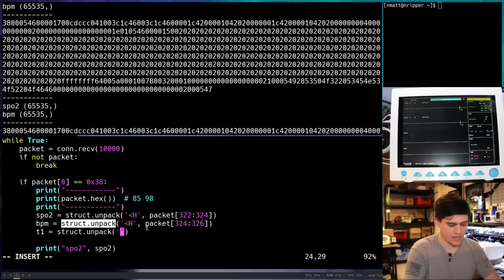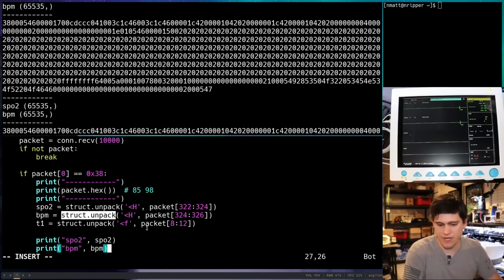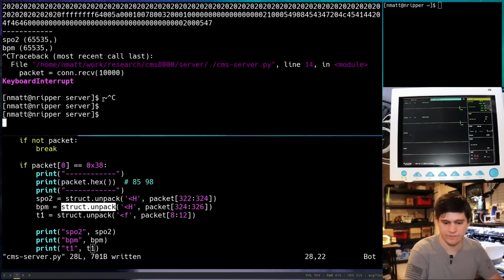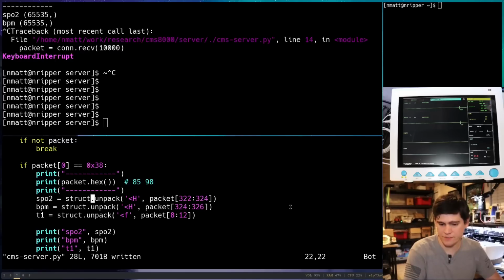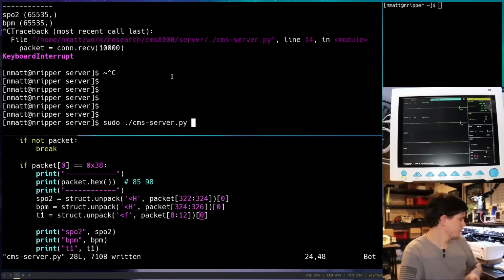And we're going to say, you know, there's our endian flag, F, comma, packet, and our offset is going to be 8, and then we're going to go 4 bytes, so 12. So there's our packet, and we are going to print out T1, our floating point value. Oh yeah. Here, we're gonna kind of fix this up. We're gonna have it not print out in that tuple format. There we go.